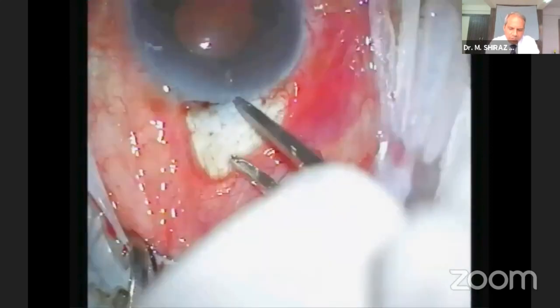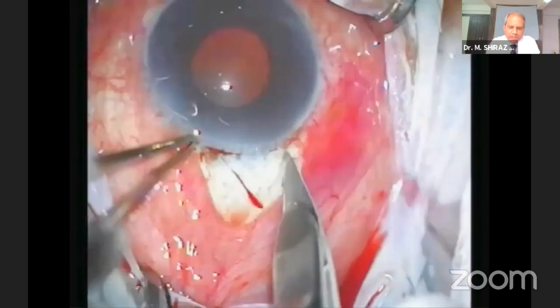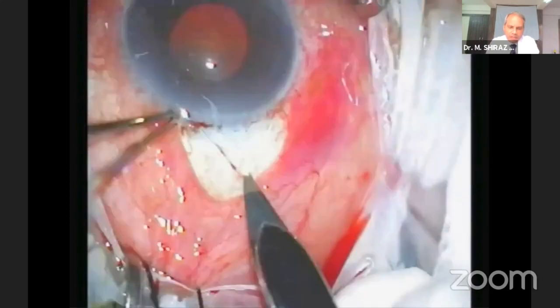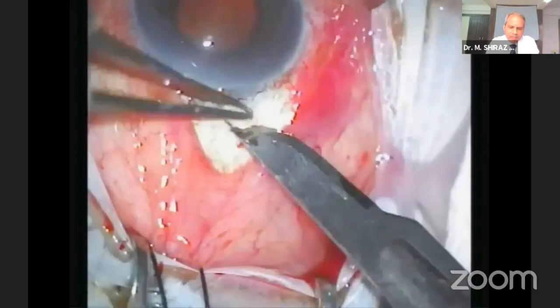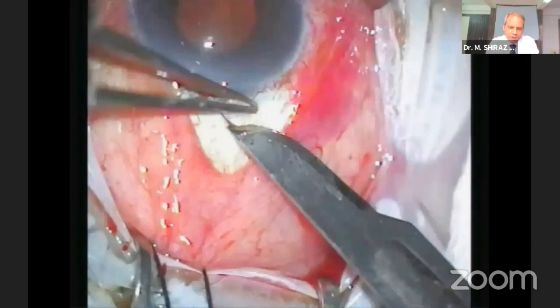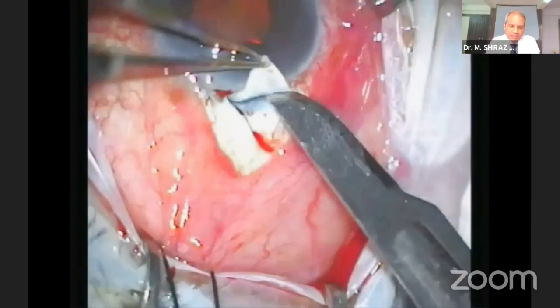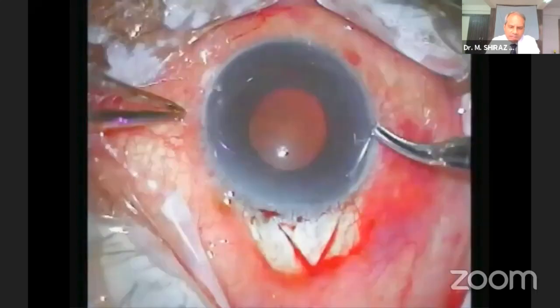A scleral flap size of 4x4 mm or 4x3 mm is good enough. The triangular scleral flap margins are demarcated using a number 11 blade. The scleral flap is dissected using a number 15 blade. The dissection should be kept at half of scleral thickness. Each scleral incision is made in one continuous movement.